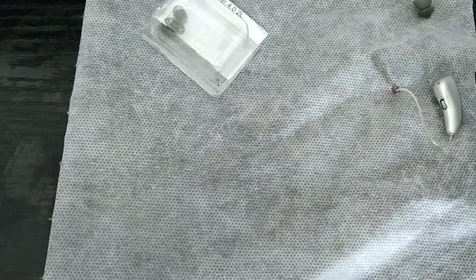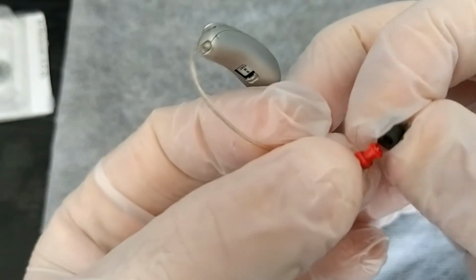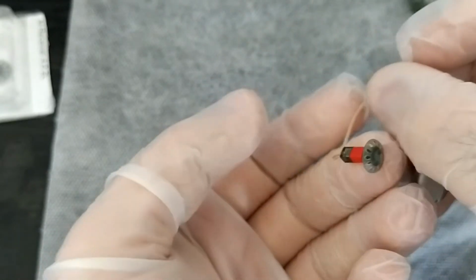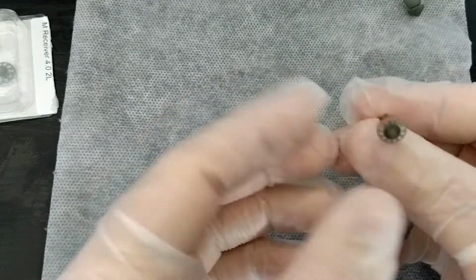Once you've done that, you want to replace your dome. So I've got some spare domes here. You take the end and you try and put that in there. Make sure it's nice and flat. So now you've got an open dome with a red for right hearing aid. And there you go. That's it.